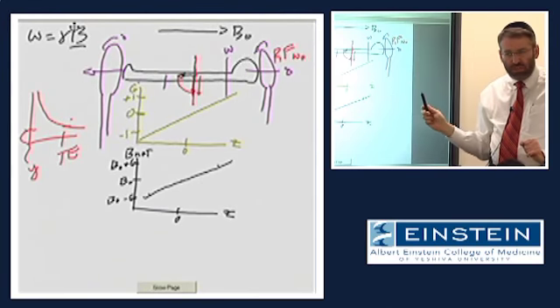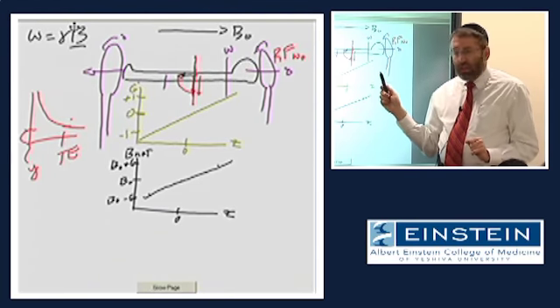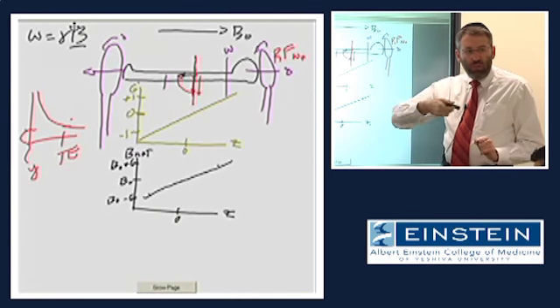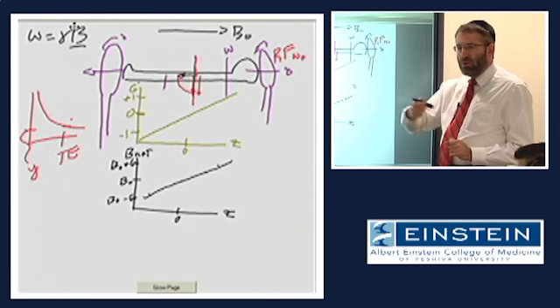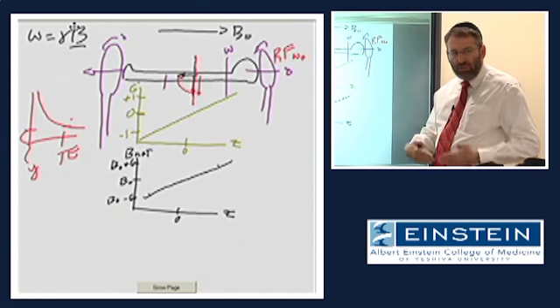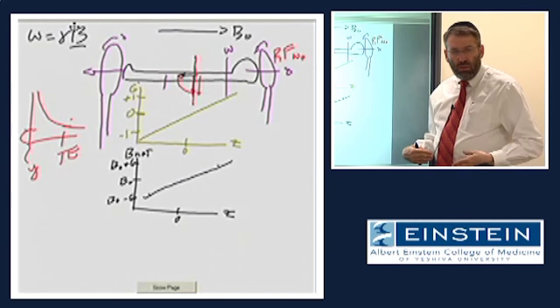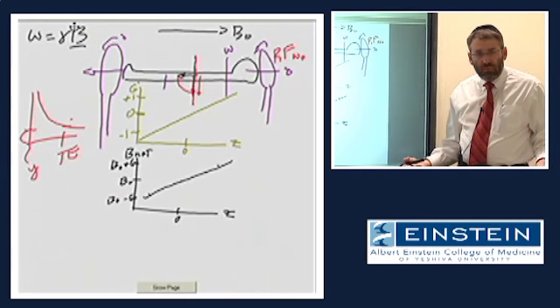So if I was interested in a coronal slice, I would turn on not this z gradient, but I would turn on the y gradient magnetic field, which if I was lying back in the scanner would be going floor to ceiling. My slices are now selected perpendicular to that gradient magnetic field, and that would give me the coronal slices I was interested in.